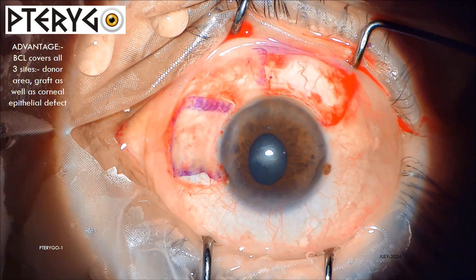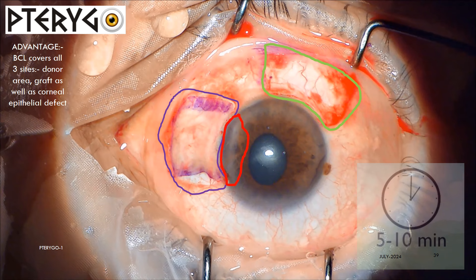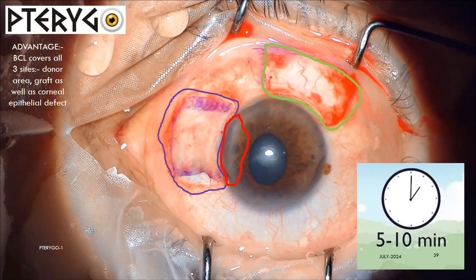The Pterygo BCL covers all three sites: the donor area, the graft, as well as the corneal epithelial defect. So there is almost no pain or foreign body sensation, and all three sites heal much faster under the shielded protection of the Pterygo. The surgery also becomes faster, usually taking only 5 to 10 minutes.